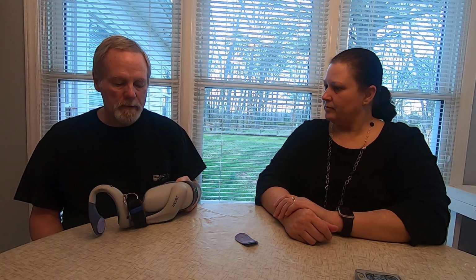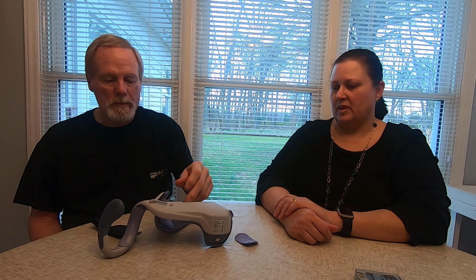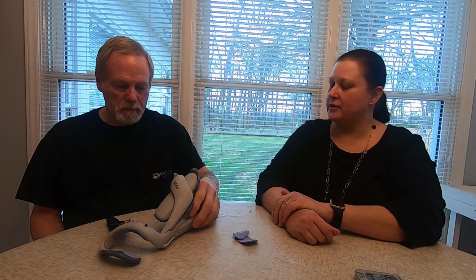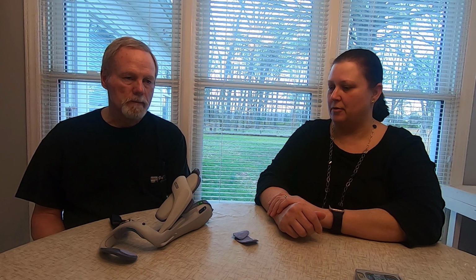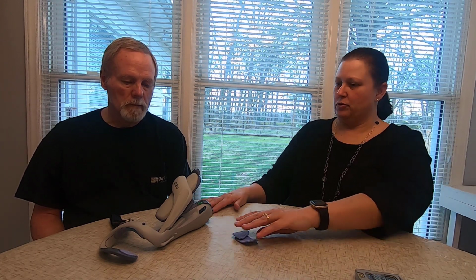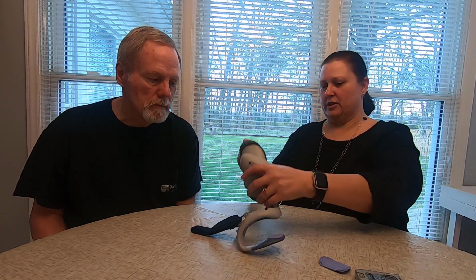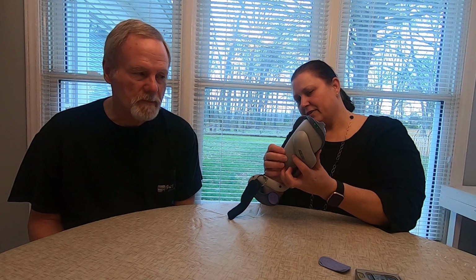Then put the machine on your hand. I can't really get my hand in it to bend it around my hand, so I need somebody to help me. Yeah, this is one of those tasks that he's not able to do himself. I know we did the video, but I thought we could show real quick here how we put it on your hand. I'll put these pads back on that you took off.